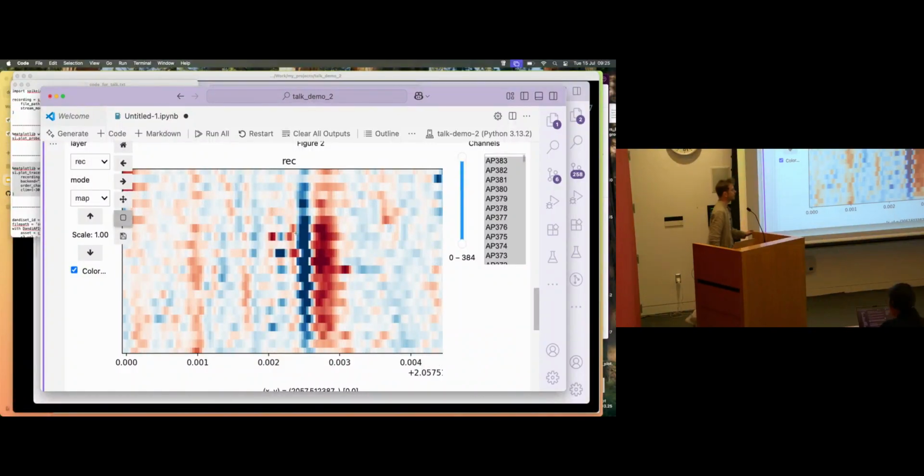okay, that might be a spike. So what these colors represent, this is time, this is 0.004 seconds. Noise, noise, noise, noise, noise. Electrical signal gets negative, and then positive, and then back to noise. That's a spike. So we've streamed and pre-processed the raw recording live, and we're visualizing a real spike in the data. Pretty cool.